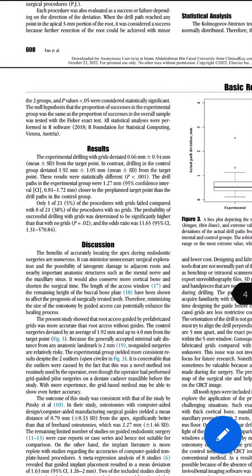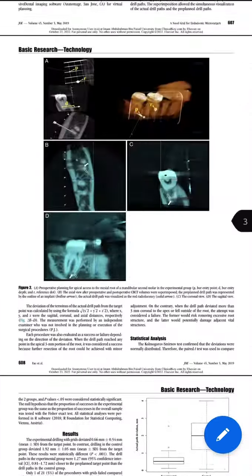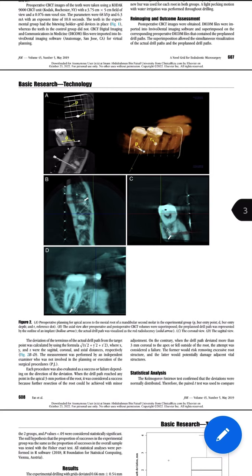In my opinion, this is a simple technique that requires no additional equipment and minimal cost and effort to help in achieving a much more predictable surgical procedure when indicated. I would say it's the poor man's surgical guide, or a surgical map, if you will.